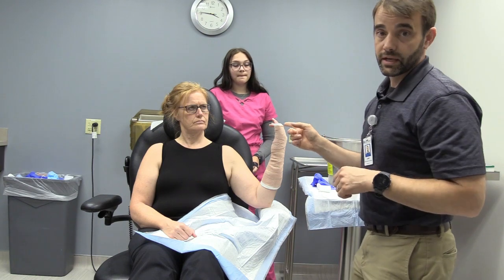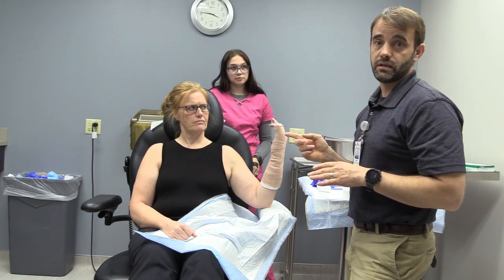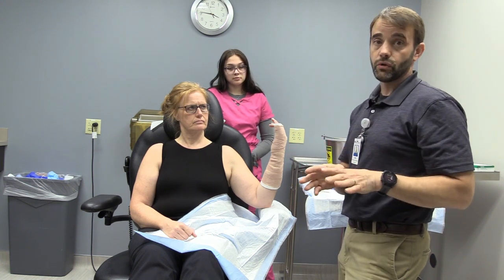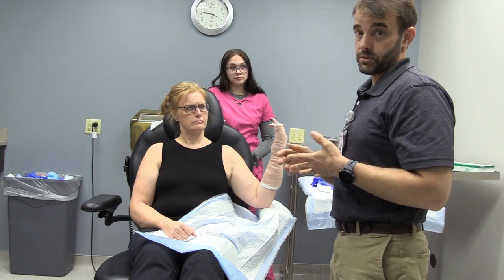The other thing I didn't mention is that if they have any rings on, you've got to get them off because their fingers will swell and it can cause some pretty serious issues. So take any and all rings off anytime they put a splint on a wrist or a hand. And that's pretty much it for that one.